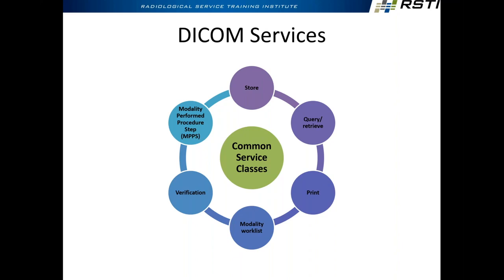Another service class you should use is what's called DICOM verification, right next to this. Yeah, DICOM echo. A very important one for this next hour. And verification and DICOM echo commonly get confused with ping. What's the difference? What are you using ping for? Ping is basic. Ping is checking nothing medical. It's only the network, the hardware, IP addresses, that kind of stuff.